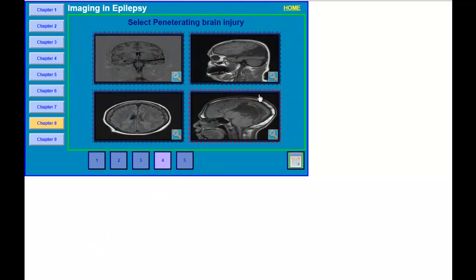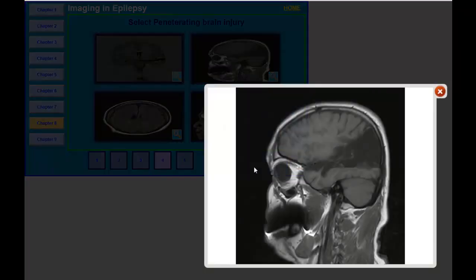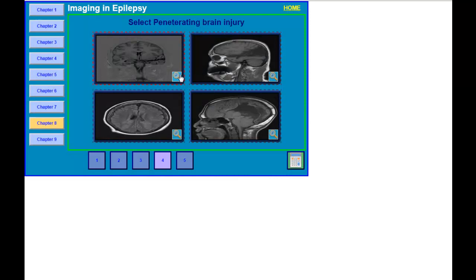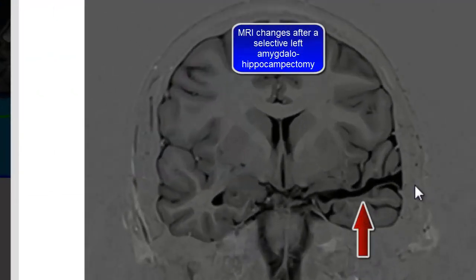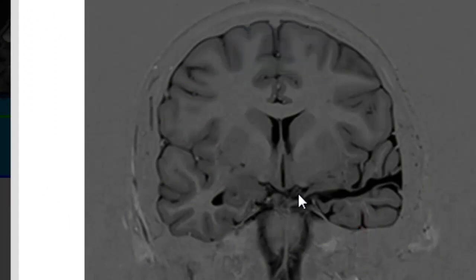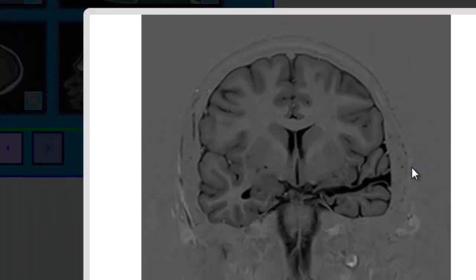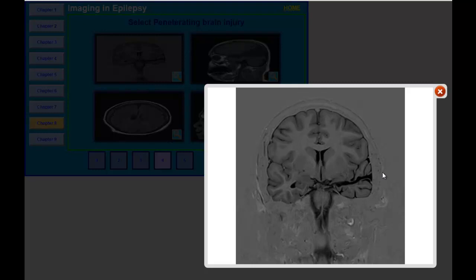The next question is to select a penetrating brain injury. This is a patient who had an accident where a metal spike went just adjacent to his eyeball all the way to the cortex and caused this damage — this is the penetrating head injury. I will also show you another MRI: this is what the surgeons do in a selective amygdalo-hippocampectomy — this is the pathway they take to scoop out the hippocampus and amygdala. This is a post-surgical coronal FLAIR image showing what your MRI will look like after a selective amygdalo-hippocampectomy.